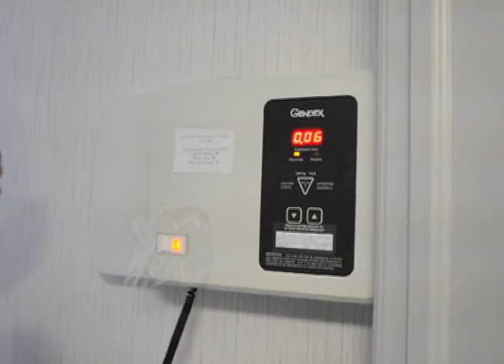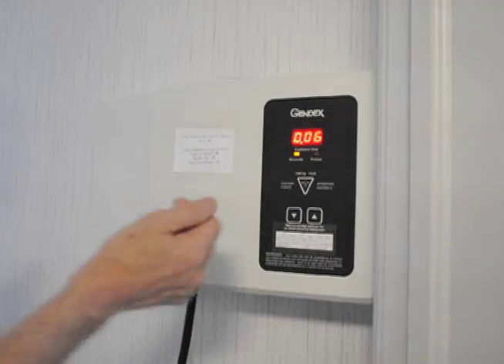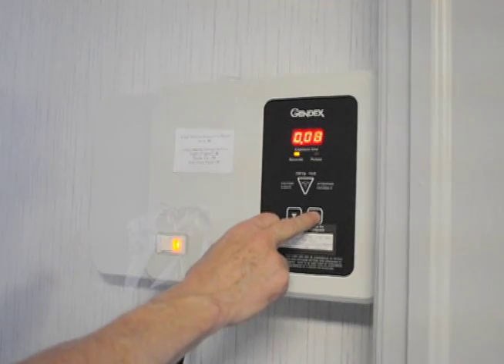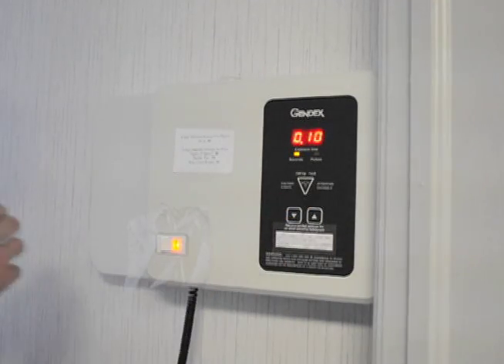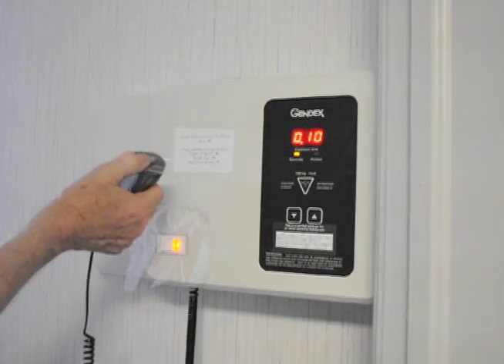Okay, now we're going to change the exposure time to 100 milliseconds. So that's a tenth of a second, and we'll shoot again.